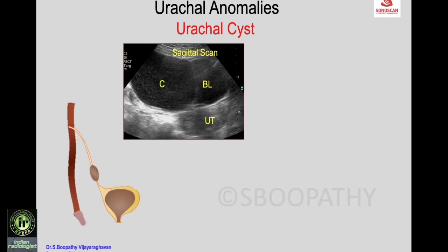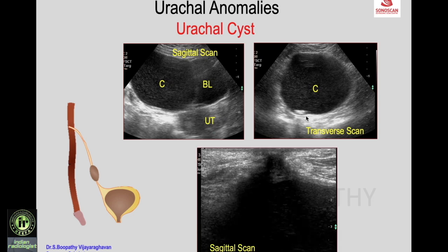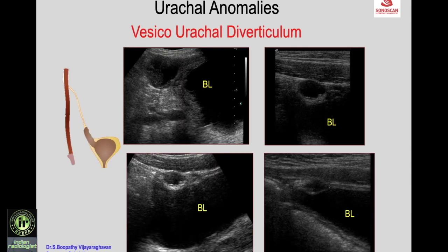A urachal cyst may be closer to the bladder. In an adult female, a large cyst is seen indenting on the bladder. Transverse scan shows the cyst with a calculus. High-frequency scan confirms the cyst is continuous with the umbilicus, confirming a urachal cyst; due to its size it also indents the bladder.